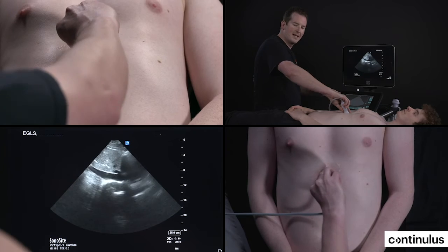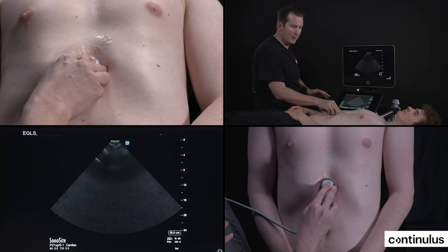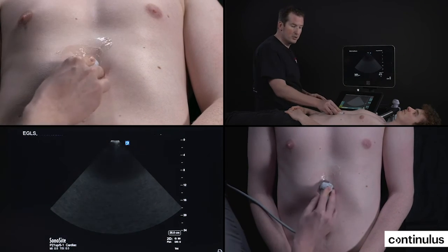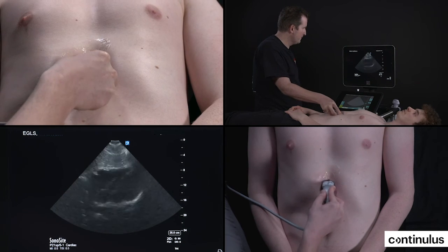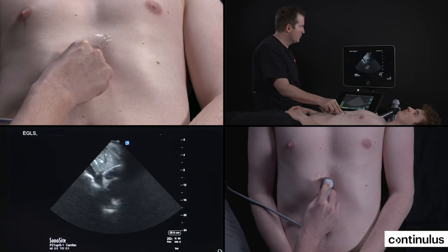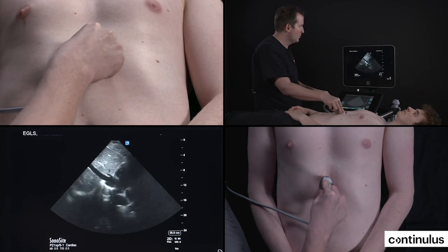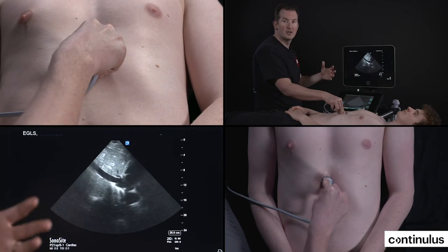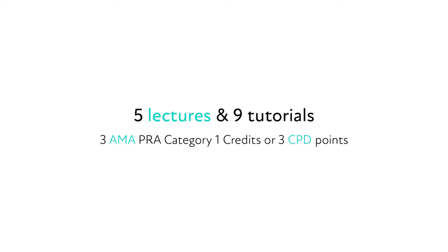Now, as I'm doing this, I feel my shoulder going up and twisting. So if we go back, what I can do instead of turning my whole arm is to turn the probe with my fingers. I'll just find the view again. There we go. I turn with my fingers, and as I turn my fingers around the probe, I find the IVC right here, rock to center it in the center of the screen, and then I do my usual adjustments, rotation and tilting, to find the longest IVC and to see it midline.